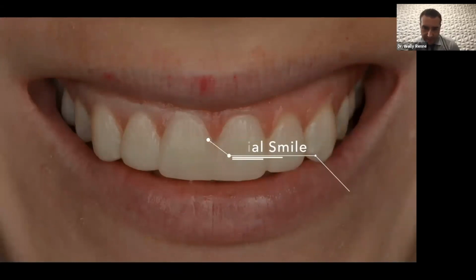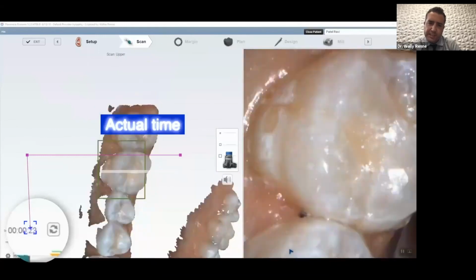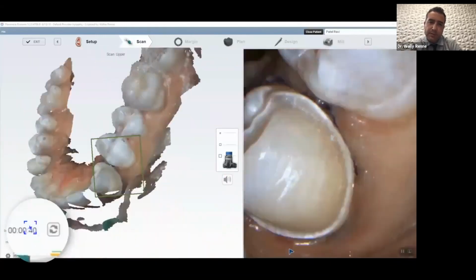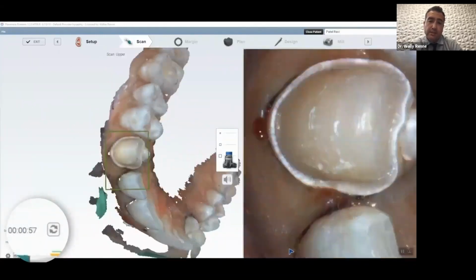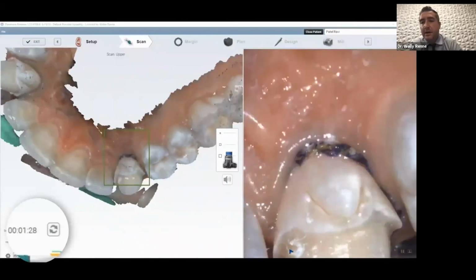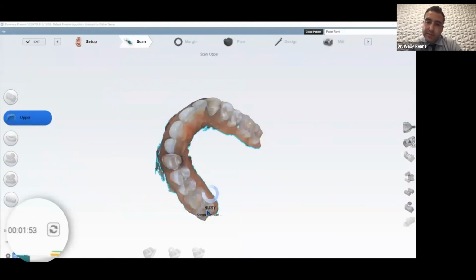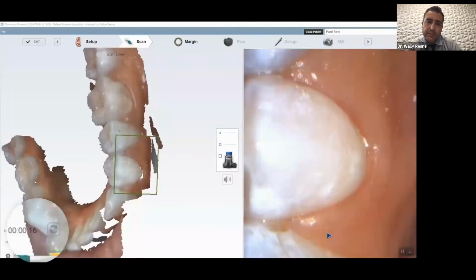Okay, so the patient, I think, may be a little bit too bulky here or there, and we might have to do some preps. So here she is on the day of preps. We decided we need to prep the canines based off of that additive wax up, based off of the transfer to the smile with the putty wash of the 3D printed model. We knew that we had to bring the cuspids down a little bit more lingual.